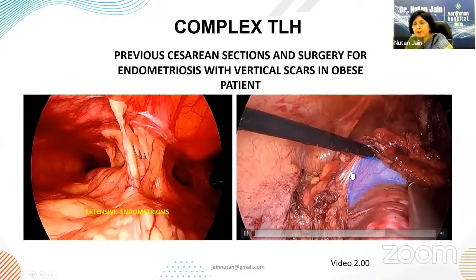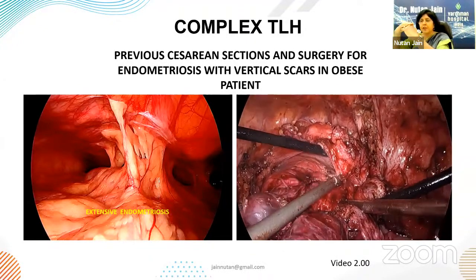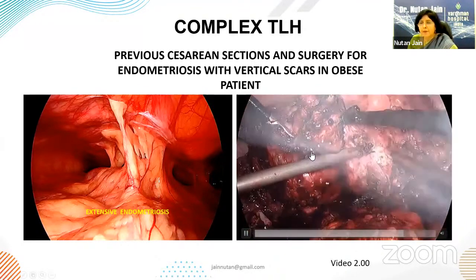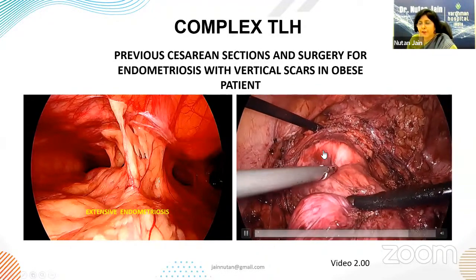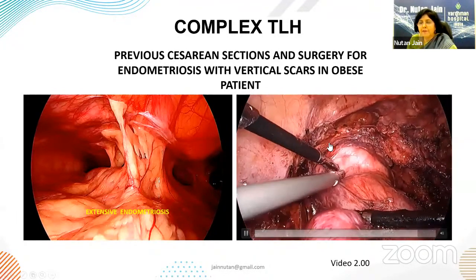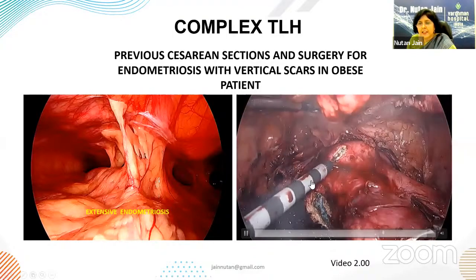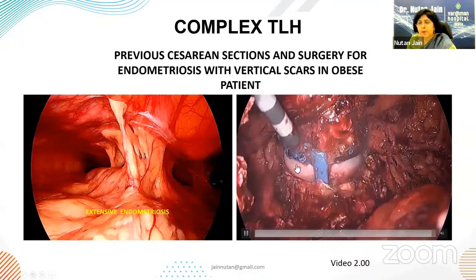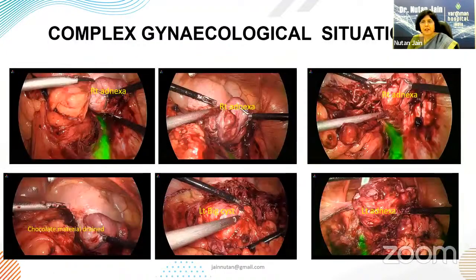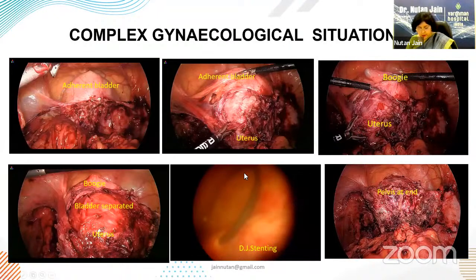I'm just showing you that in the face of these nightmarish adhesions everywhere, the bladder remains adherent on the top, but we reach a very handy plane of cleavage beneath. So this is a new concept. I'm expecting to face a lot of antagonists. Let's see what the points come up. But we have been doing it for the last 5 years, and we find that the plane of cleavage comes in very handy. Though it was a totally hopeless case, the bladder dissection and all the rest were completed. I think we finished.